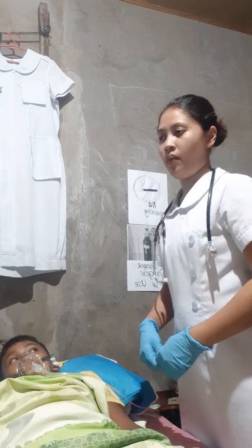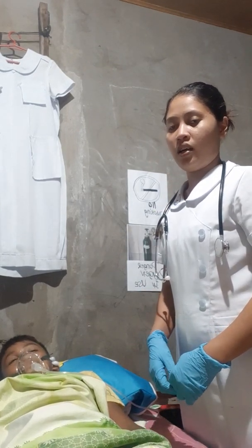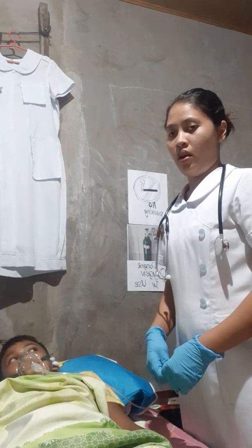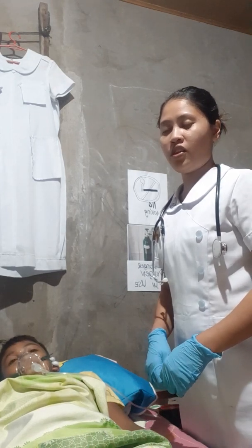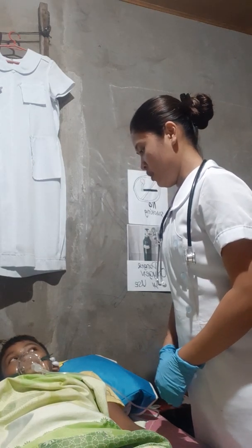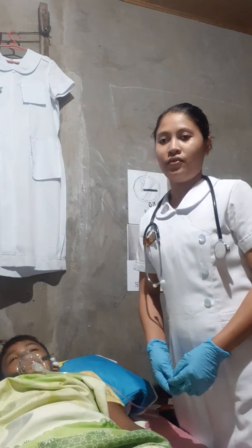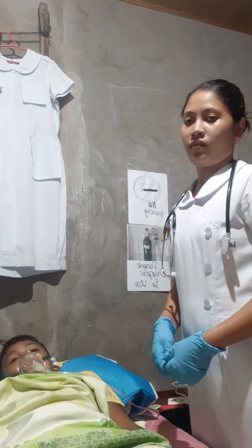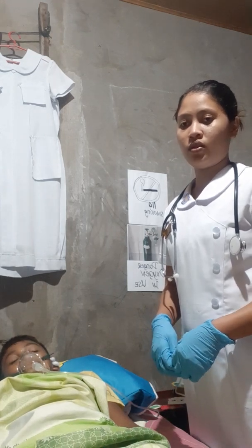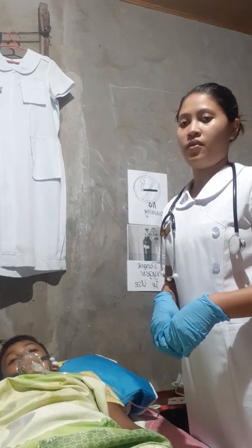Afterwards, for the evaluation, reassess the client to determine the response towards the procedure, oxygen therapy using face mask. So, sir, are you alright with the procedure? Yes. Okay. Afterwards, for documentation, record in the nurse's notes from the beginning until the end of the nursing shift.